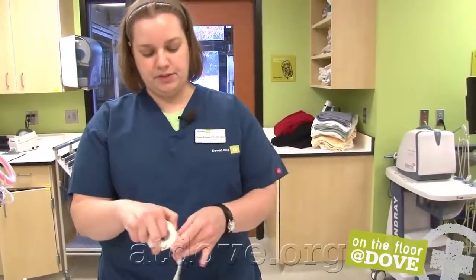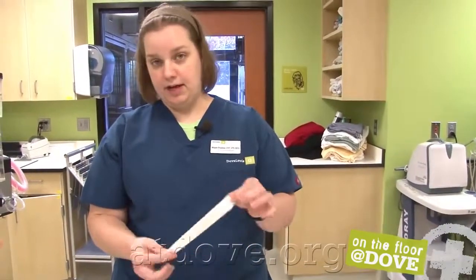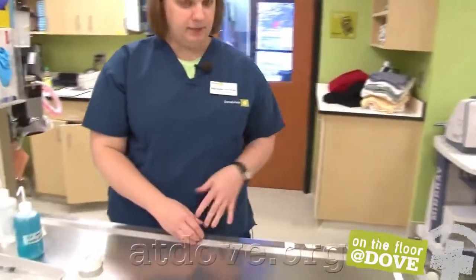Third piece of tape is what's going to secure the T-port to the leg. I like to make little tabs at the end so it's easy to remove. And then the last piece will be to make a tension loop with our fluid line extension set. So I've got my tape here ready to go.